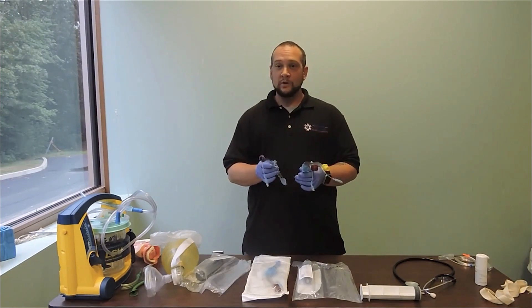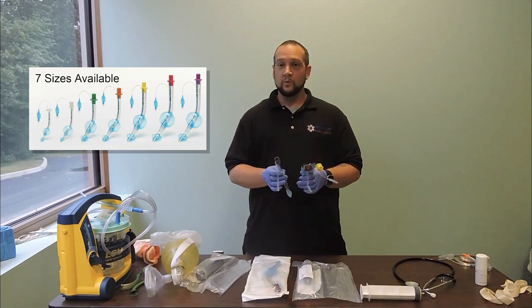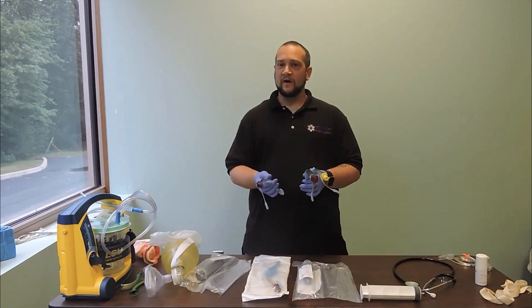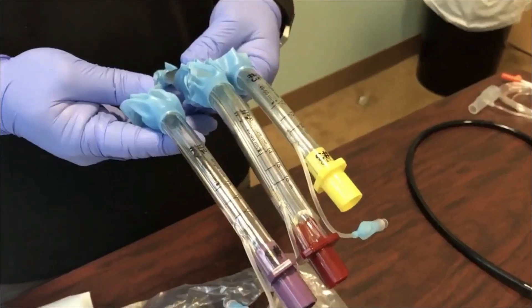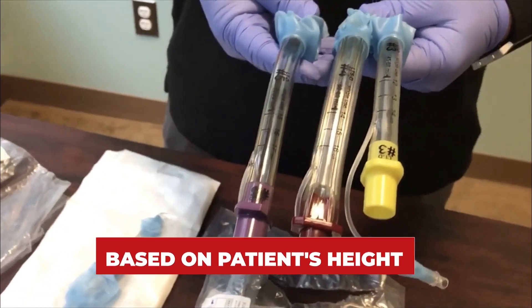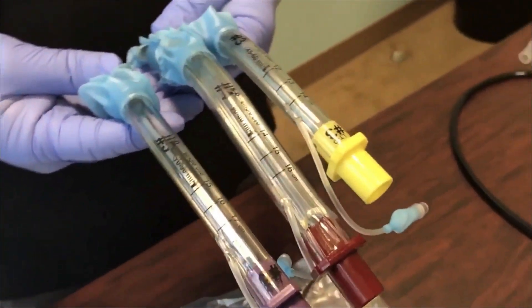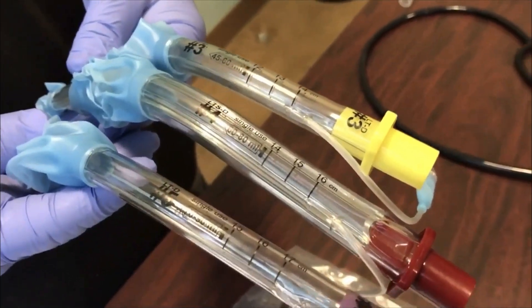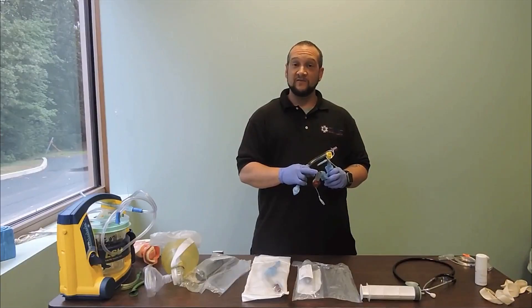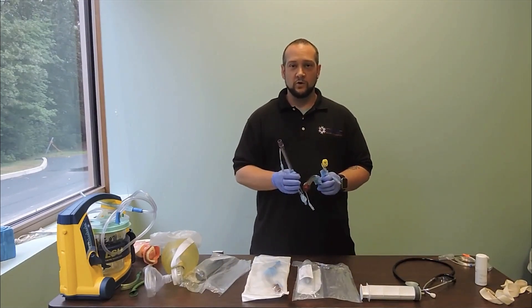Our King Airway devices come in sizes zero to five. Size zero is for anyone over five kilograms. On the ambulance, we're going to carry sizes three, four, or five for our adult patients. These devices are sized based on the patient's height: size three is for anyone between four feet and five feet tall, size four is for anyone between five feet and six feet tall, and size five is for anyone taller than six feet.